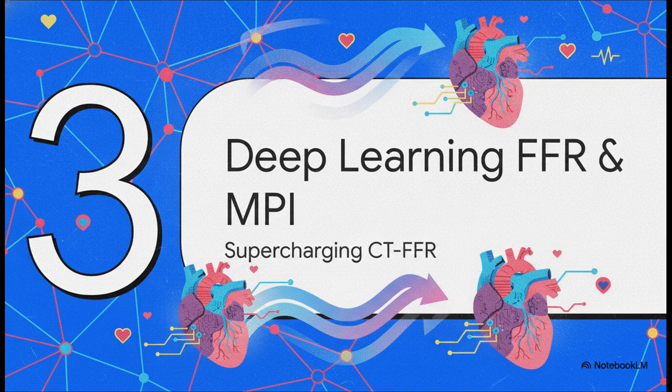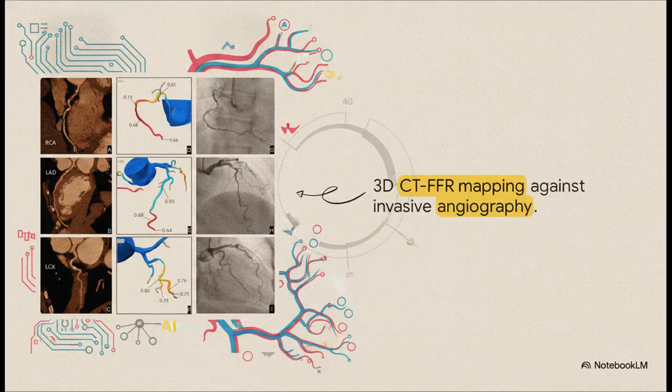Section 3. Deep Learning, FFR, and MPI. Let's talk about supercharging our tools. Whilst the morphological machine learning approach is incredible, deep learning is also stepping in to supercharge traditional CT-FFR itself. When you look at these 3D CT-FFR maps mapped out against invasive angiography, you really see the difference. Traditional CFD-based CT-FFR takes hours to compute. Why? Because it relies on solving complex Navier-Stokes physical equations for fluid dynamics on a massive supercomputer.